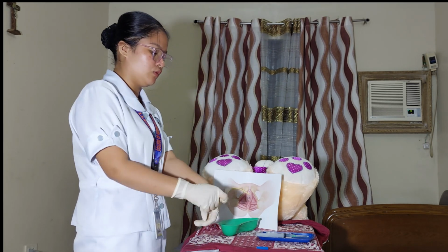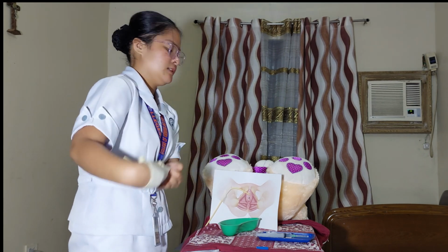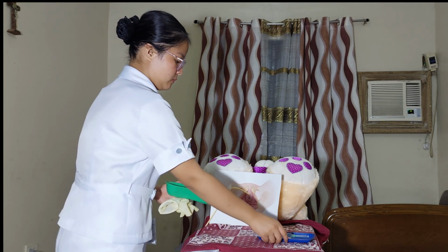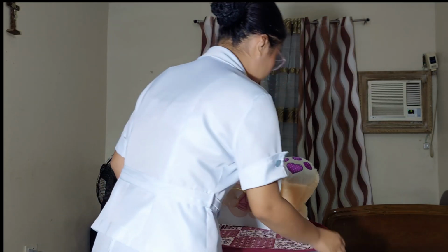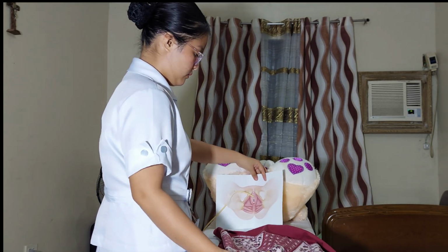So now I'm going to remove my sterile gloves and dispose of them together with the urine. And I'm going to position my patient in her normal position, and I'm going to drape her. I will remove the protective pads.